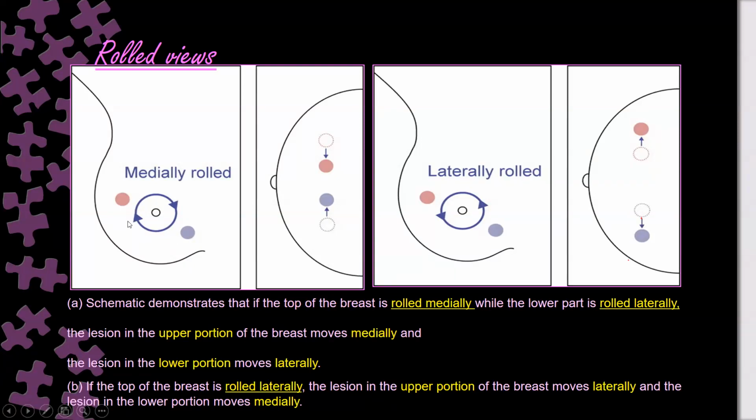This will go that direction, and this will go this direction. Here you can see it. The inferior lesions will go laterally, and the superior lesion will go medially, because I push medial, the superior will go with the direction medial, and the inferior will go against, lateral.